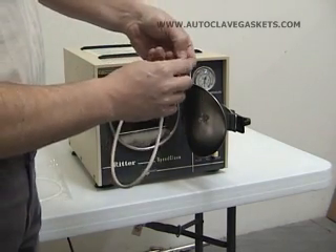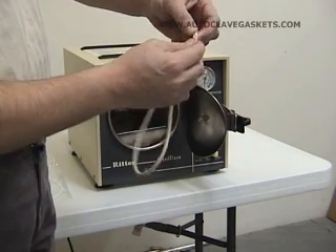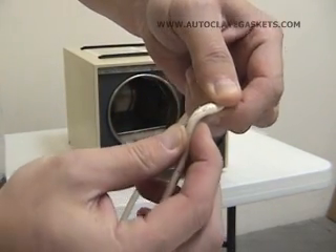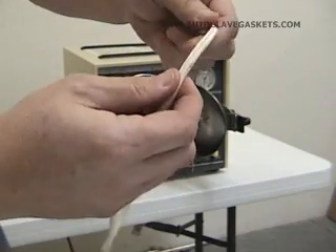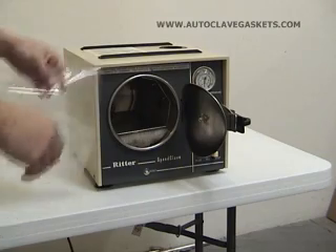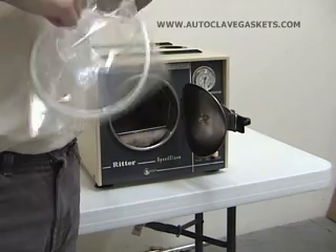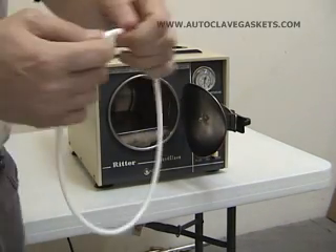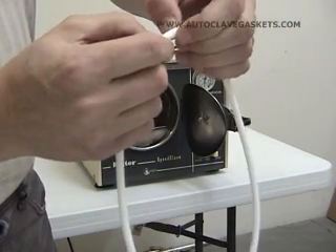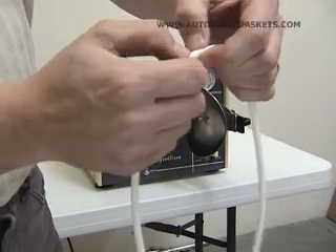One of the things you'll notice with our gasket is it replaces these hollow rubber gaskets, which are prone to actually getting holes worked into them, especially if you use a tool to remove the gasket to clean it off. Our gasket is actually made from solid rubber. So even though it has the same pliable texture, it's a solid core as opposed to hollow, so it's considerably more durable.